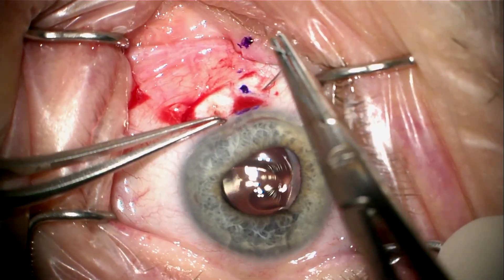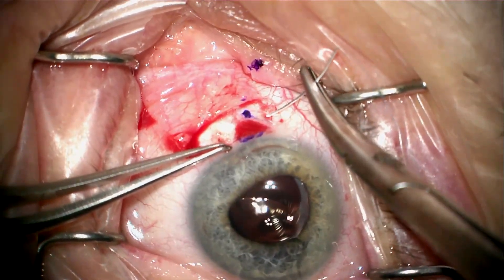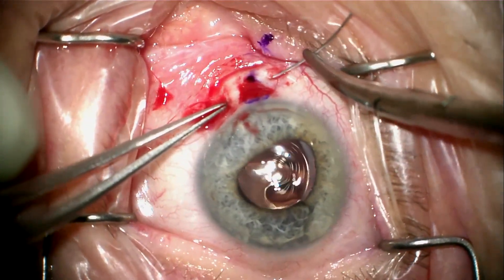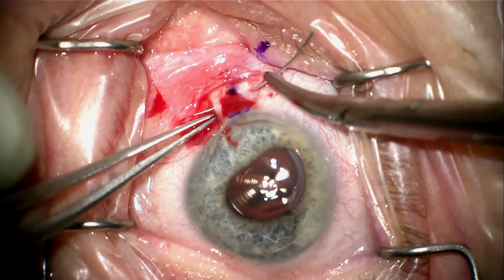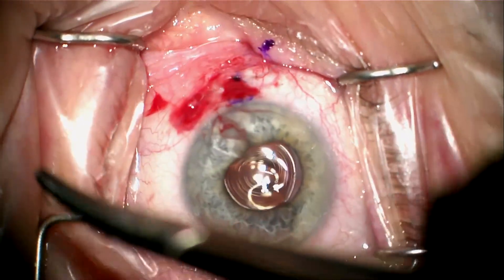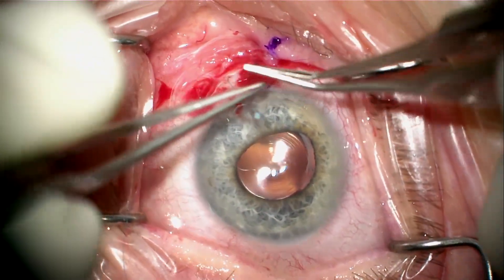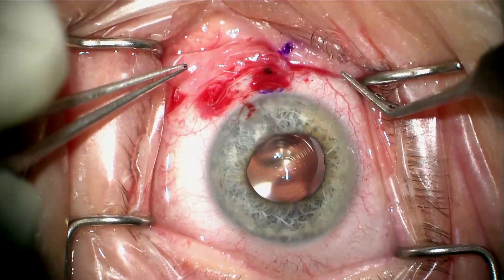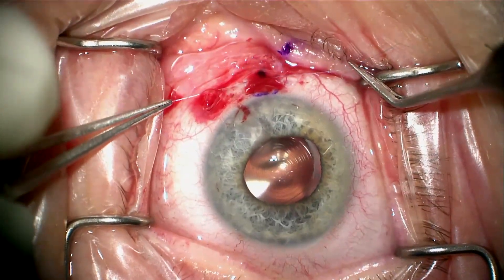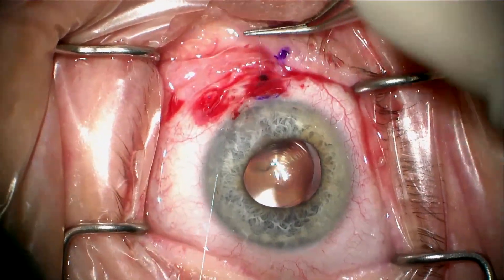I'm going to use a technique that was shared with me by Dr. Arsham Shabani. This is a CIF-4 needle that's passed completely through sclera, catches ciliary body, and is passed out through the sclera again. This is tied, creating a mattress suture that is full thickness and will hopefully approximate the ciliary body to the wall of the eye and close the cleft.